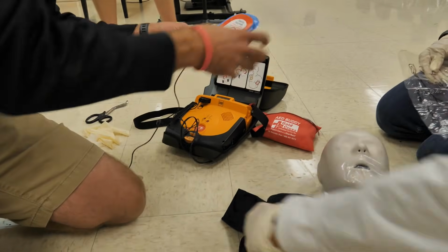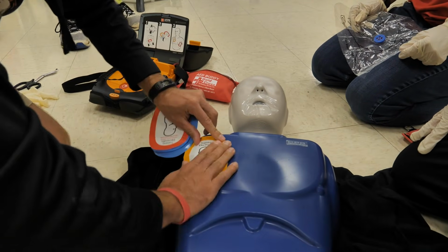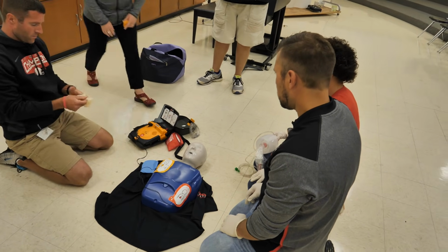Okay, just remember the yellow pad goes in the handle to open bag. Red closest to you. No, closest to you. There you go. That goes lower. Look at pictures on pad. Do not touch patient.